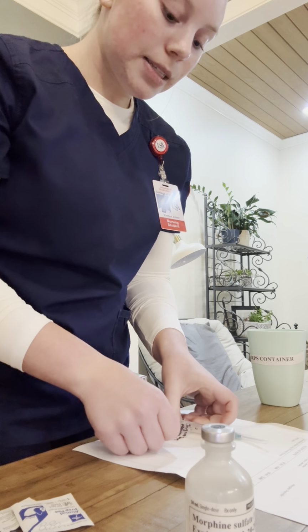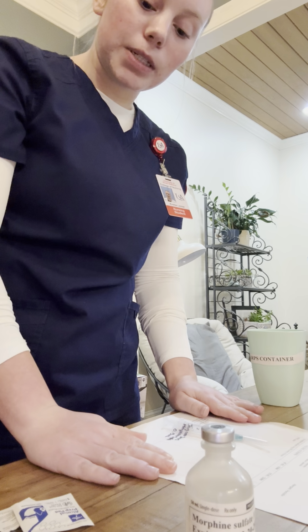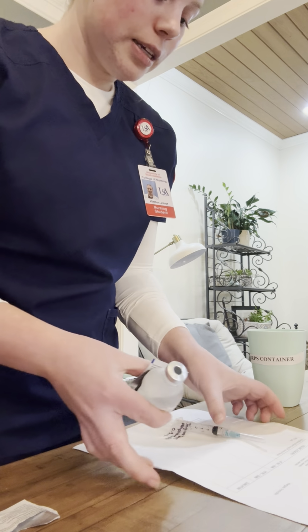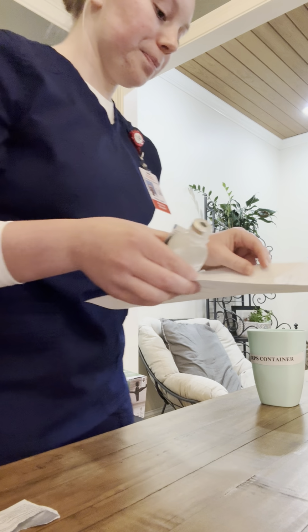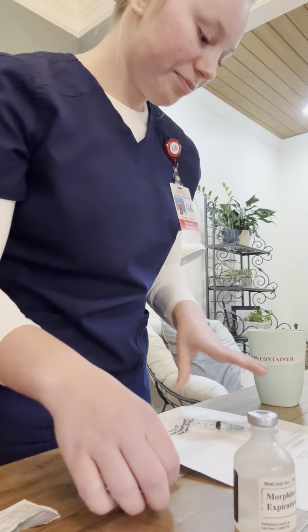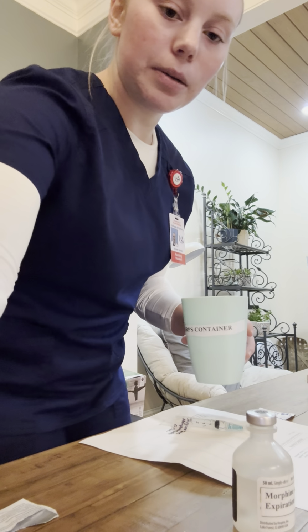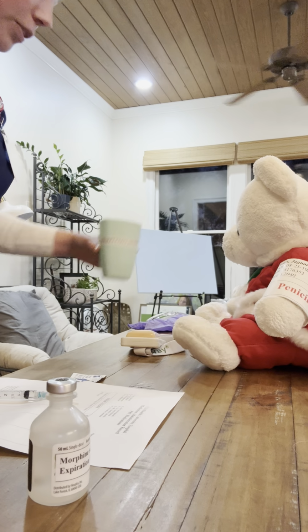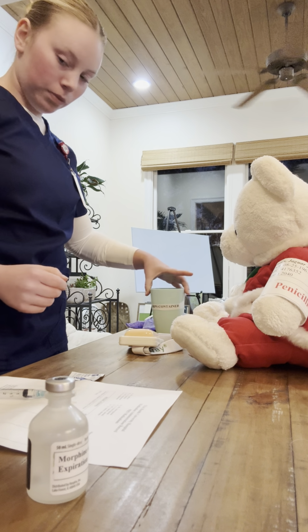So now that my second check for accuracy has been done, I'm going to take these things and move to my patient room. Just right here. Okay. This is my sharps container. I'm going to move you so you can see my patient. So my sharps container is right here.